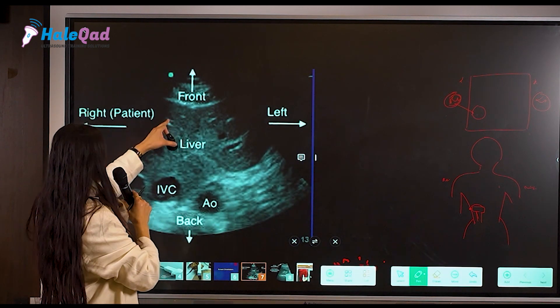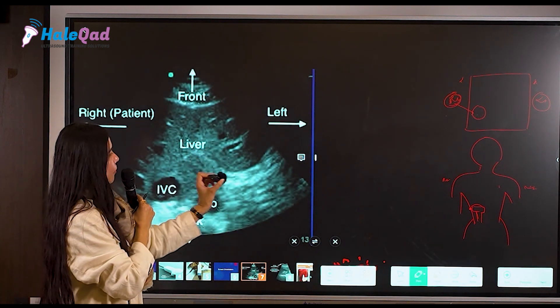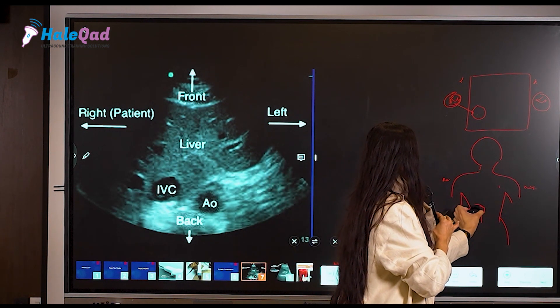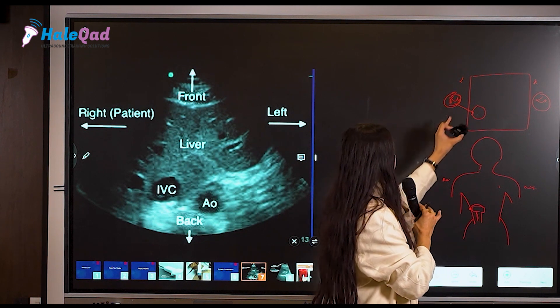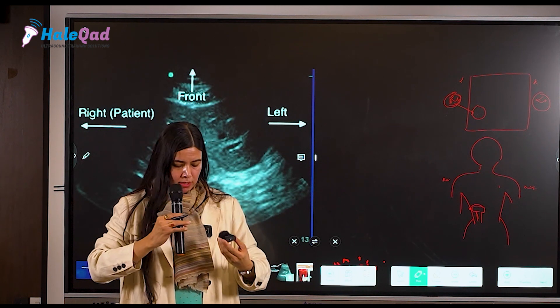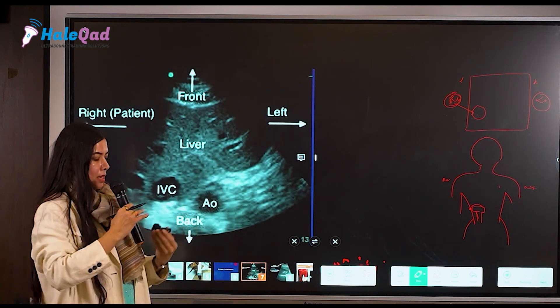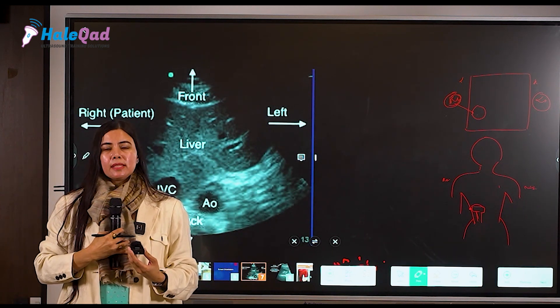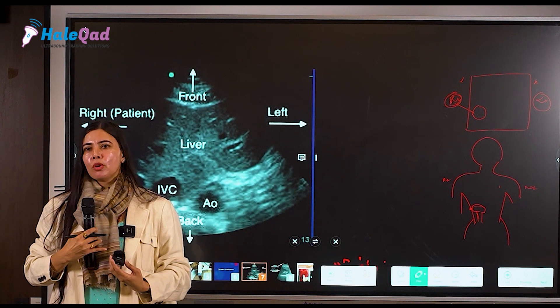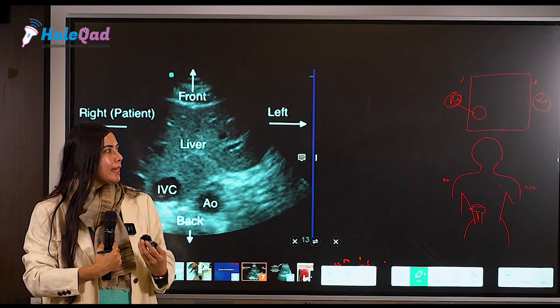This is an image of the liver that we are scanning. Try to see how the probe is held — I am holding my convex probe transversely, with the probe marker on the right. The sound waves are coming from the probe, going downward, penetrating the tissue. Whatever is struck by these waves first is anterior, because the probe is on the surface.